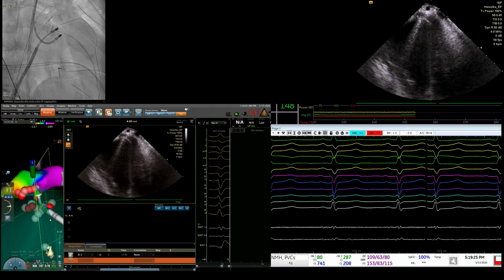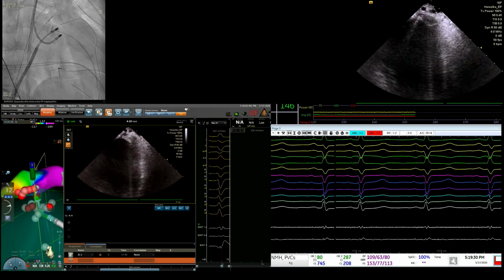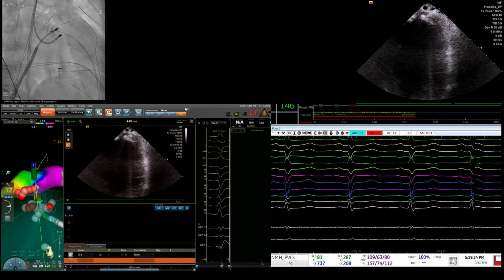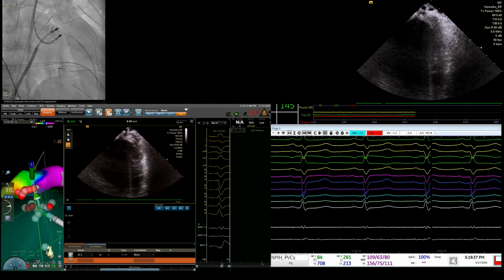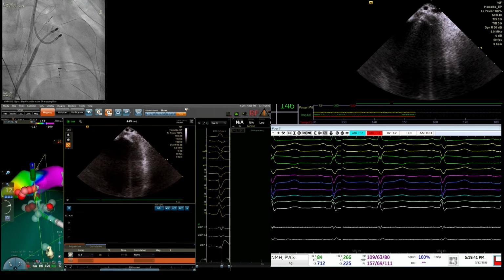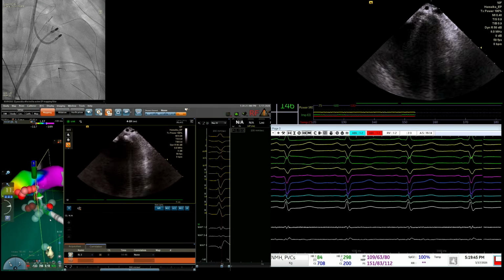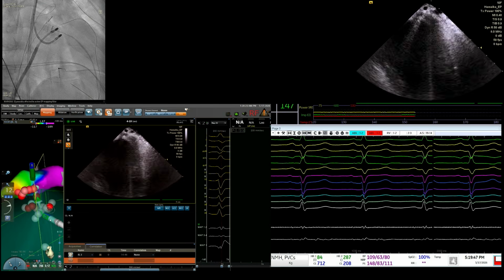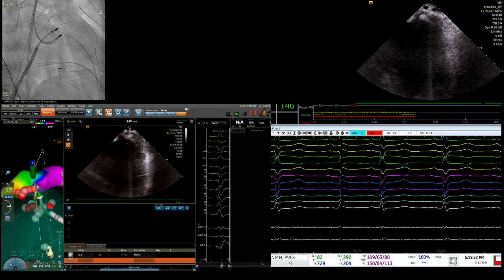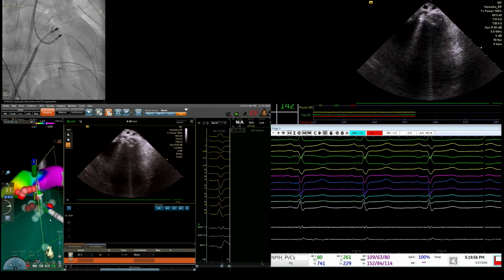Could you please repeat your question? How good was the endo? Can you please go back and show the electrogram? I was interested: how would you describe the endocardial success site or this contralateral site? Was it just below the middle of the left cusp, or closer to the aortomitral continuity? Okay, because it is not clear from your map, at least to me. You have ICE right there.